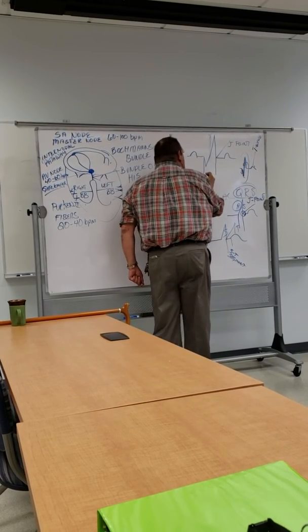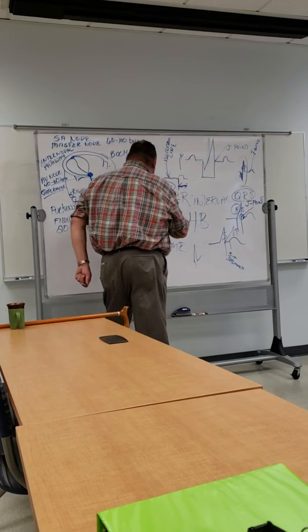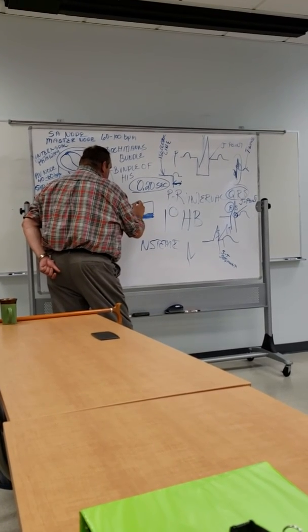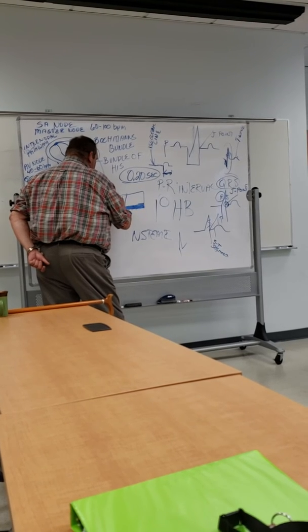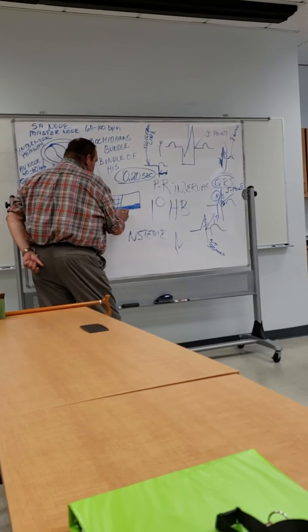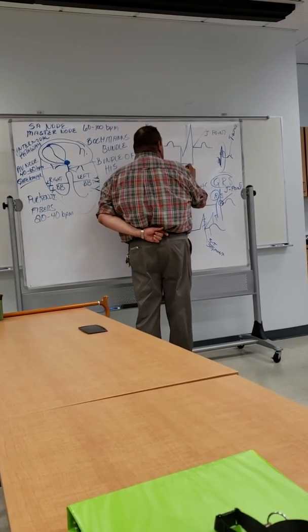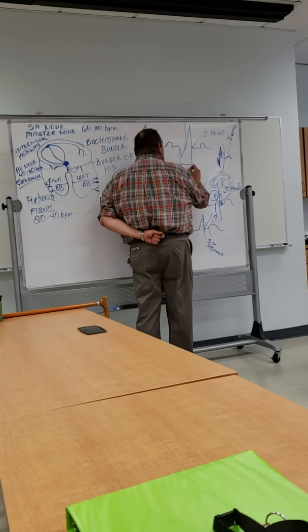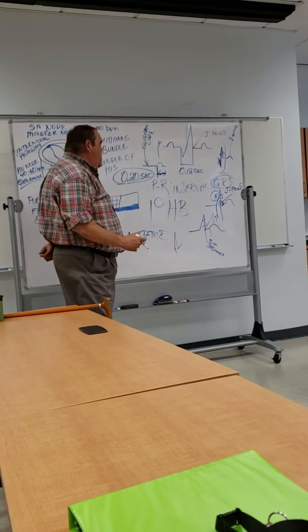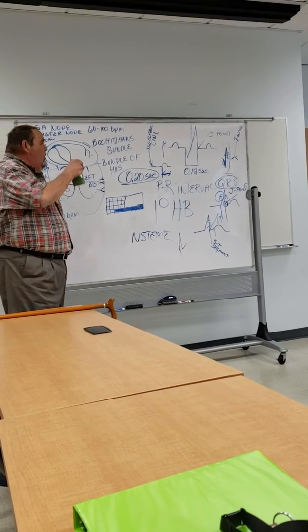The distance between here, when you're looking at this block right here, can be no more than 3 little blocks wide. That means it cannot be wider than 0.12 seconds. 3 small blocks. That's why you have to know about these blocks and the time in between them.